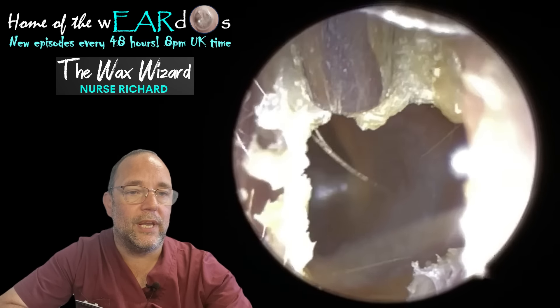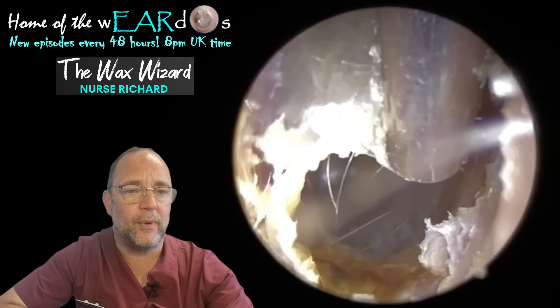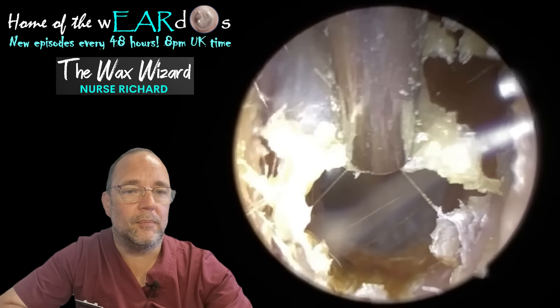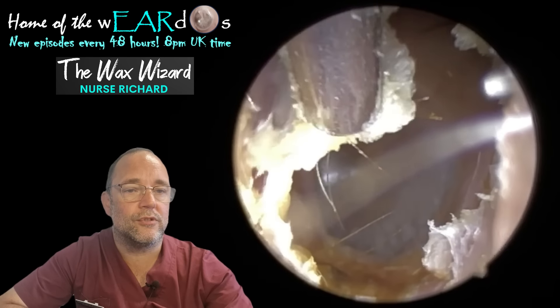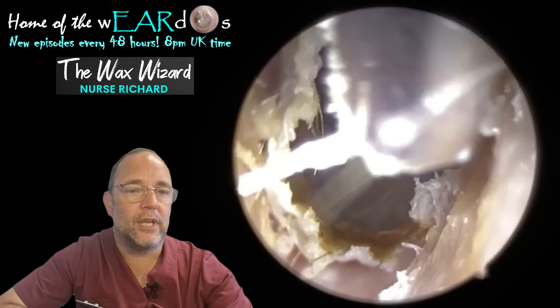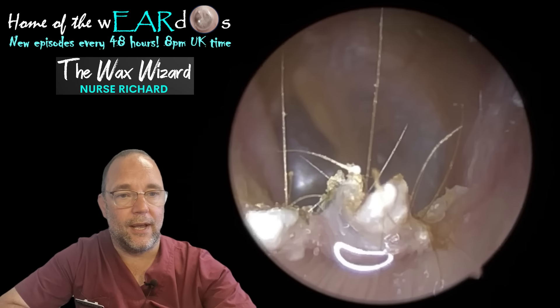It would have come out quite easily, probably with a full size tube, but it probably would have been squeaking and very uncomfortable and unpleasant for the patient, which obviously we don't want. The fine end tube, whilst it doesn't do all that squeak, it's just a bit less powerful, so it's a bit trickier to peel this off when it's as thick as it is. That's why I've put the oil in.